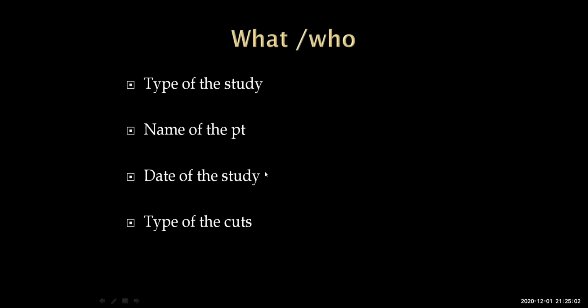So sometimes if you do your history and your examination and you don't pay attention to the MRI date, you will find that there is some mismatch. If you are lucky enough, you will find findings that are consistent with your examination and history. But better to make it a habit: check the date of the study.